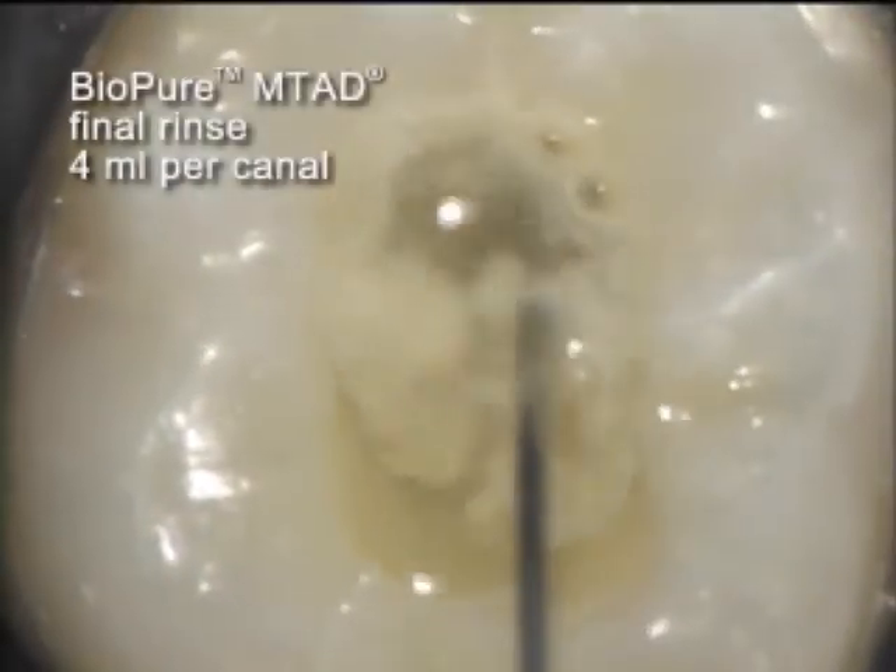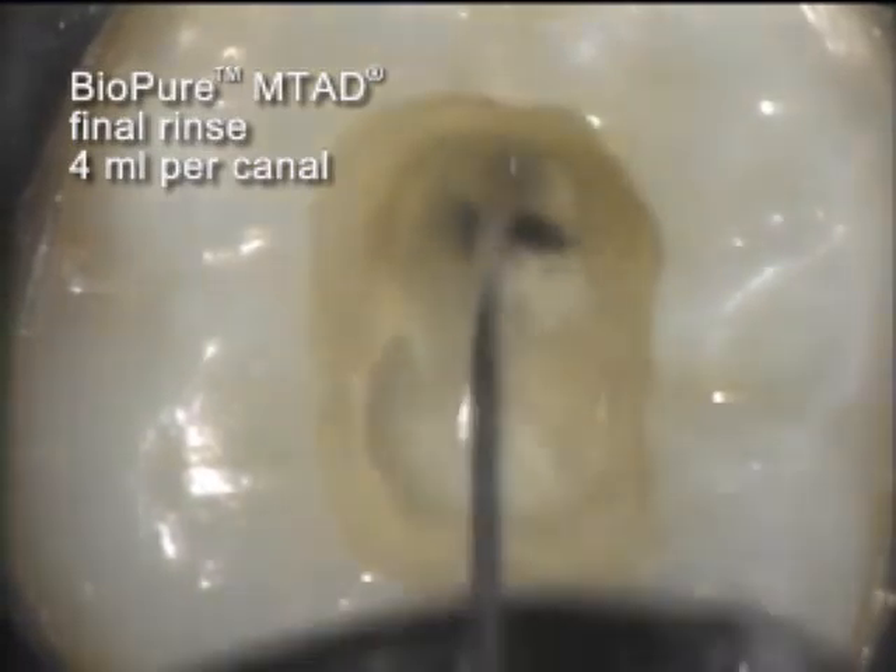This split screen shows the differences before and after the 5-minute initial soak period. A 4-milliliter per canal rinse with BioPure MTAD follows.